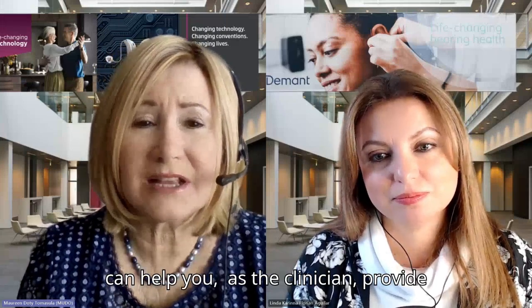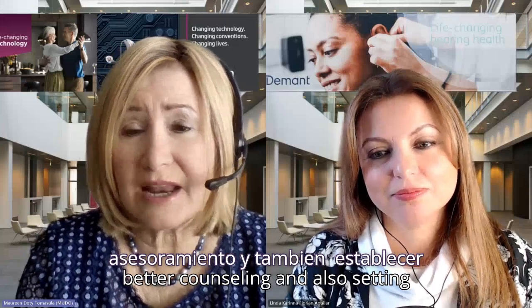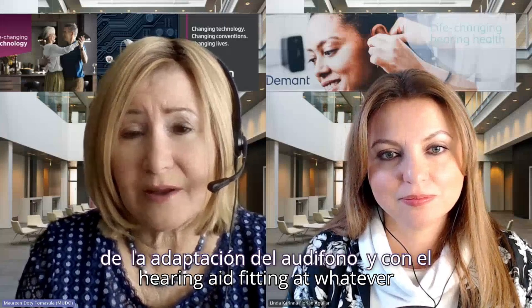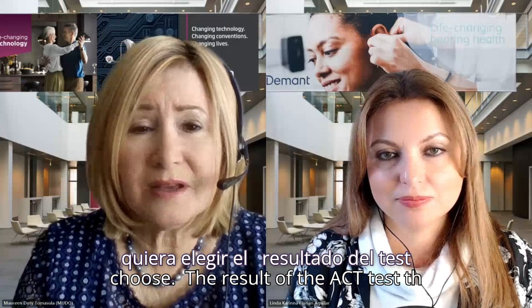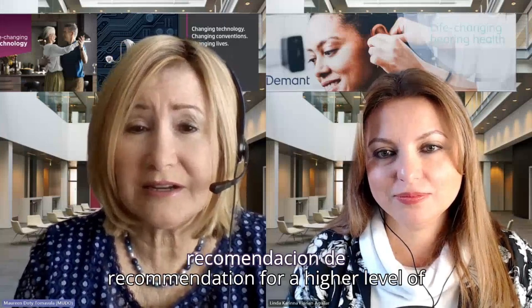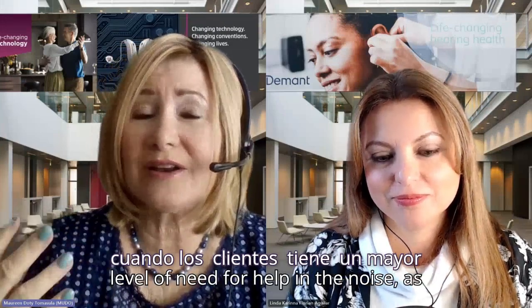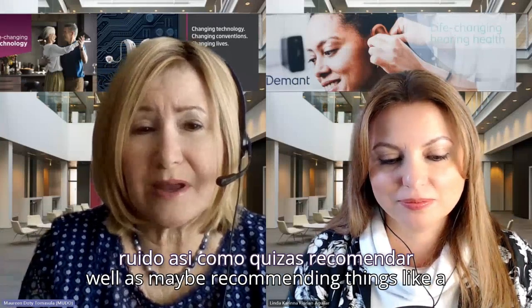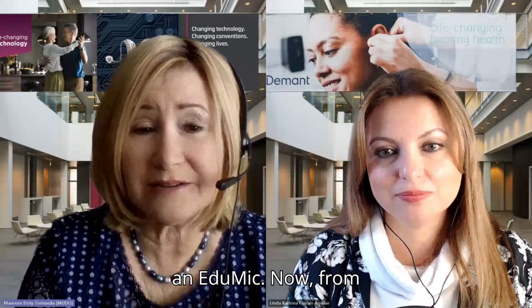This can help you as the clinician provide better counseling and also setting expectations regarding the outcome of the hearing aid fitting and whatever technology level the client wants to choose. The result of the ACT test then can also help support your recommendation for a higher level of technology when the clients have a higher level of need for help in the noise, as well as maybe recommending things like a TV adapter or a remote microphone like an EduMic.